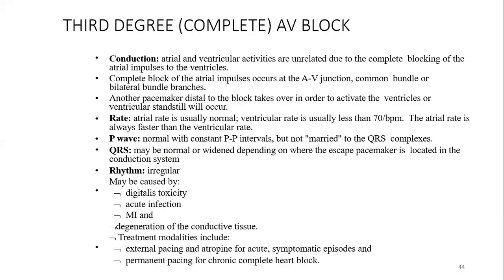Now the third degree AV block. Here, the atrial and the ventricular activities are unrelated due to the complete block.